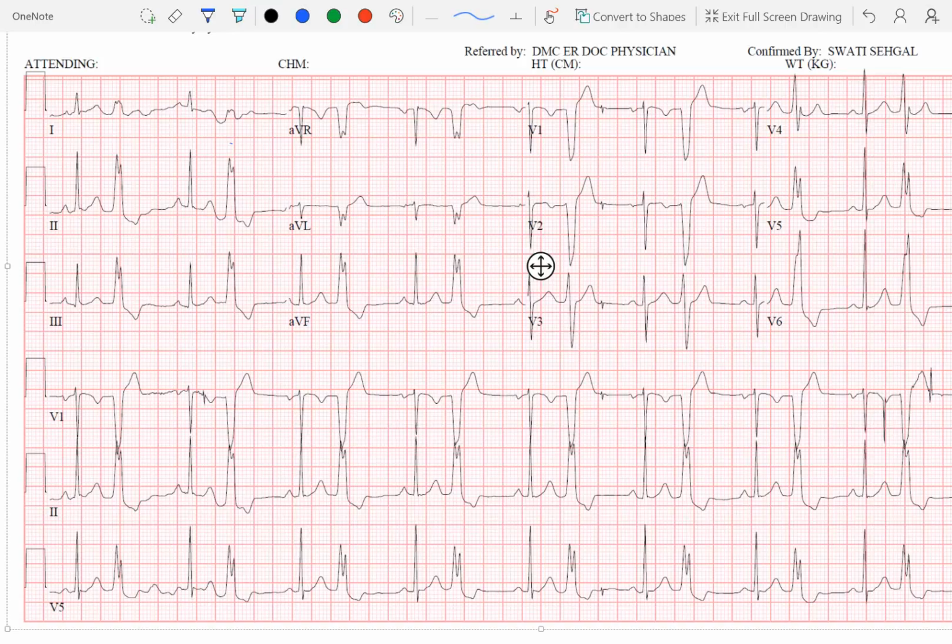Sometimes, rarely, you can have patients with arrhythmogenic right ventricular dysplasia who have PVCs coming from the outflow tract, although they can have PVCs coming from anywhere in the RV. In those patients, you might find some changes in the QRS and T waves. Usually they have inverted T waves in the precordial leads extending beyond V2, V3, and they might even have an epsilon wave. Those patients are more likely to have sustained tachycardias.